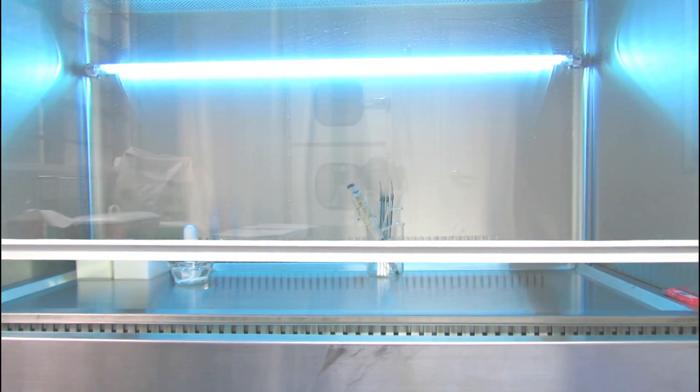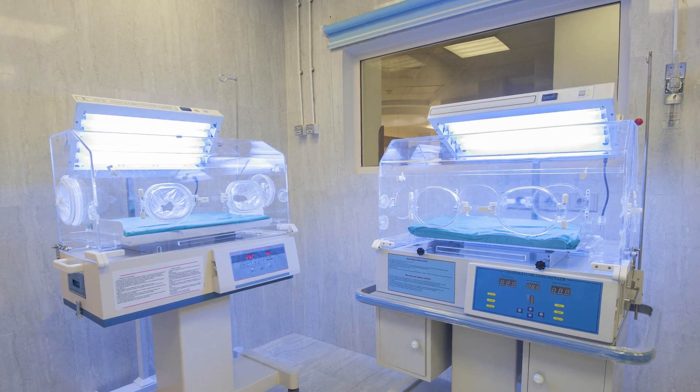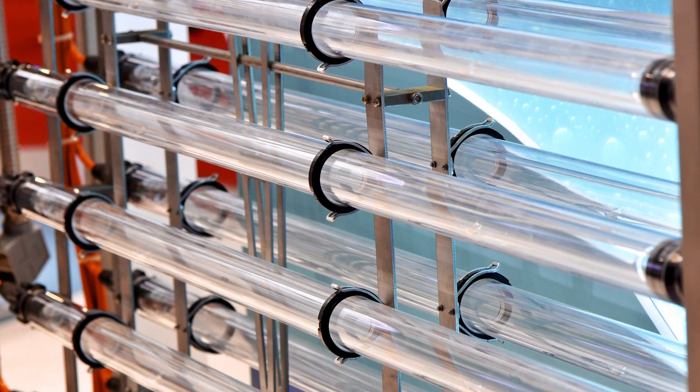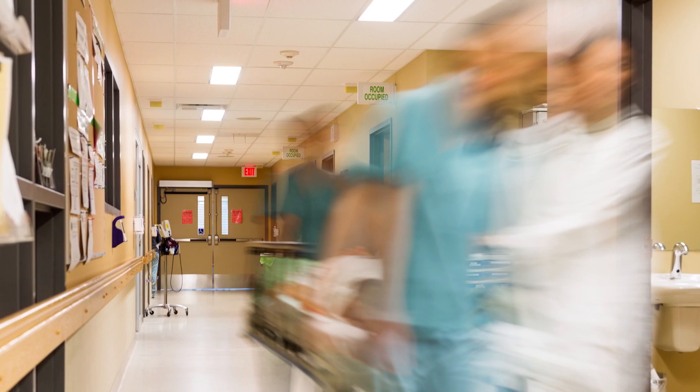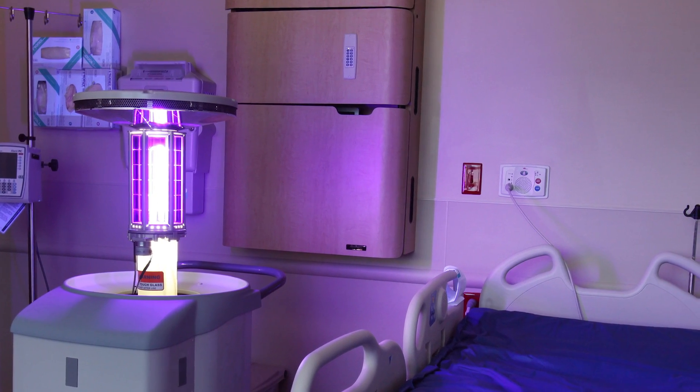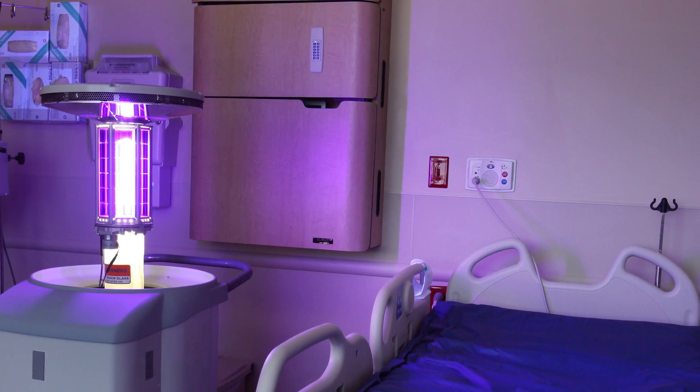UV has been used as a disinfection tool for decades in health care, but the challenge with UVC technology has always been the method of delivery. It can't be used in occupied spaces and is only effective in areas that are direct line of sight. Until now.